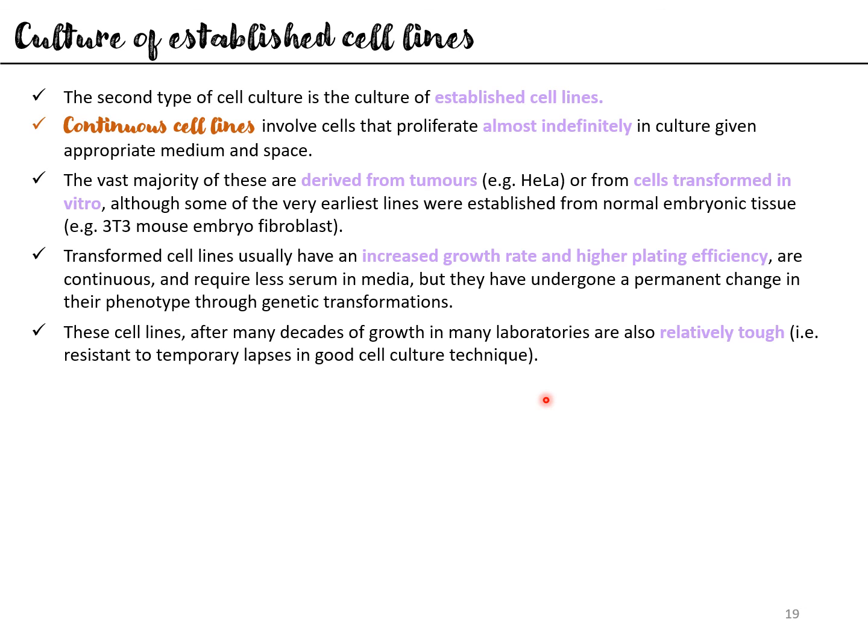With continuous cell lines, although you can afford to not be so vigilant, it is advisable that you maintain proper cell culture practices and take good care of your cells if you want the best results.